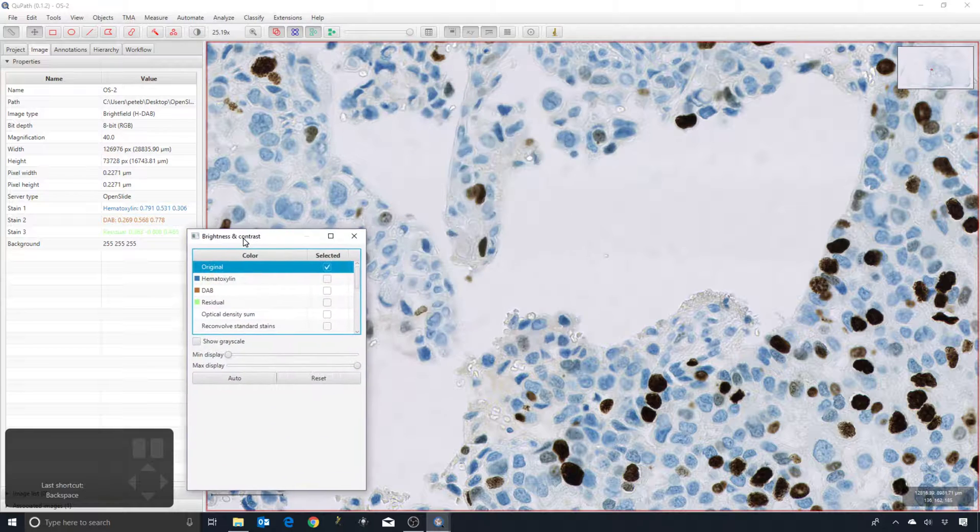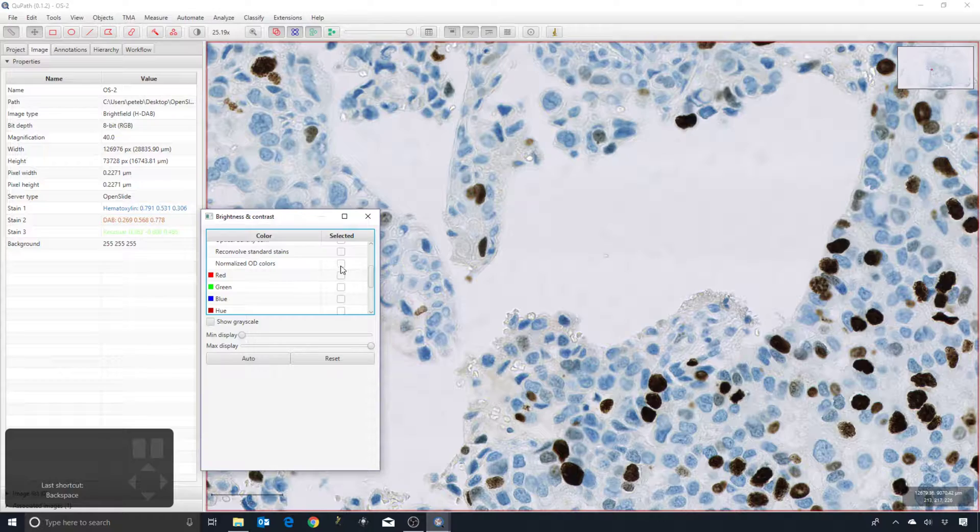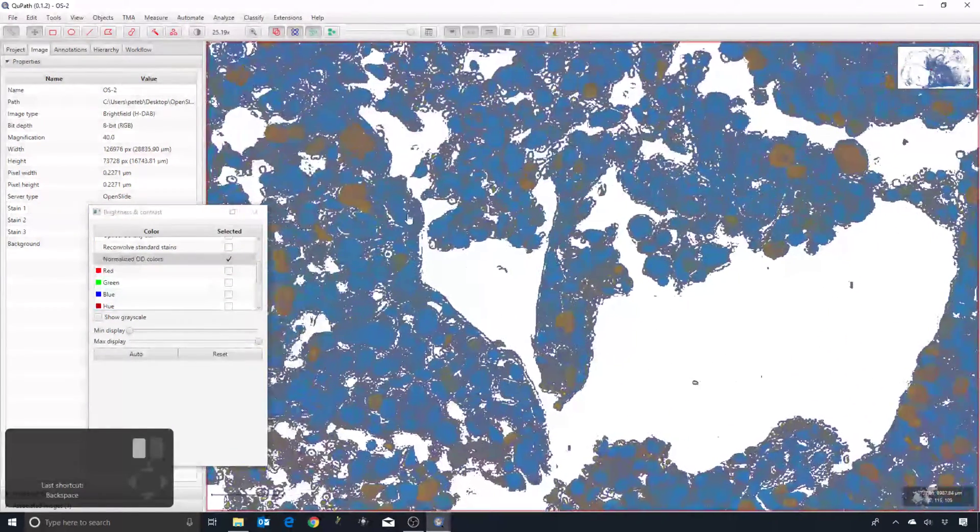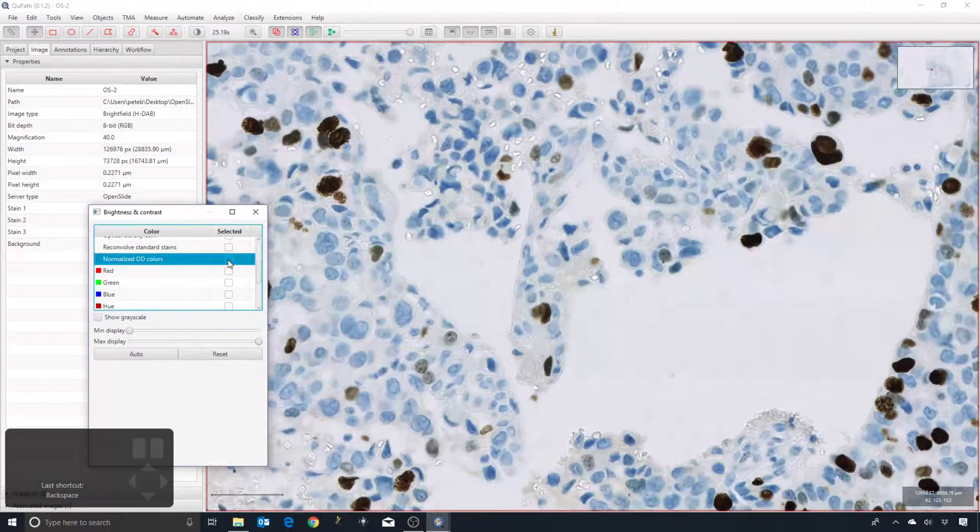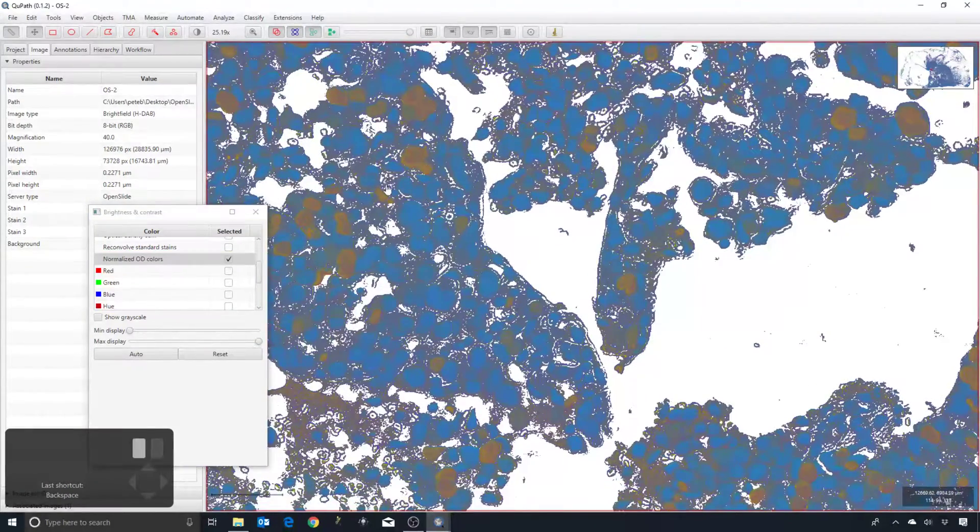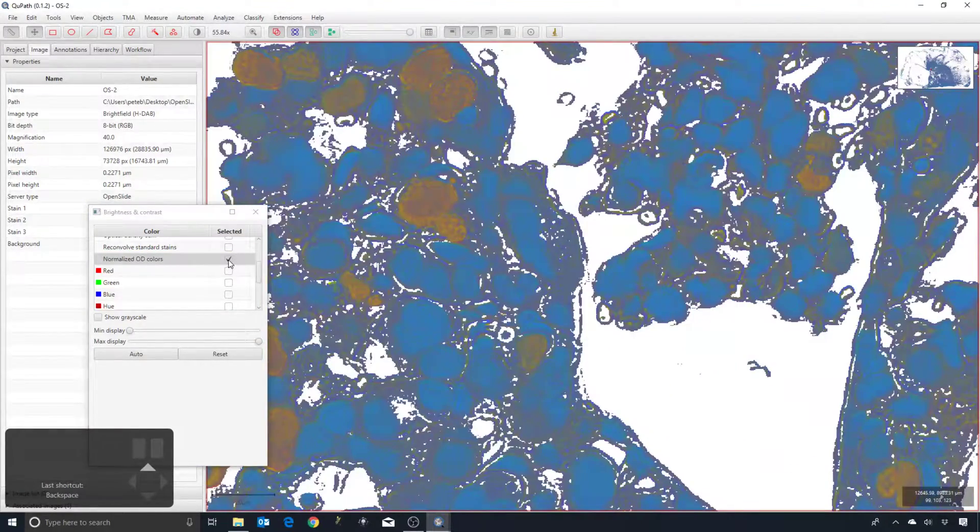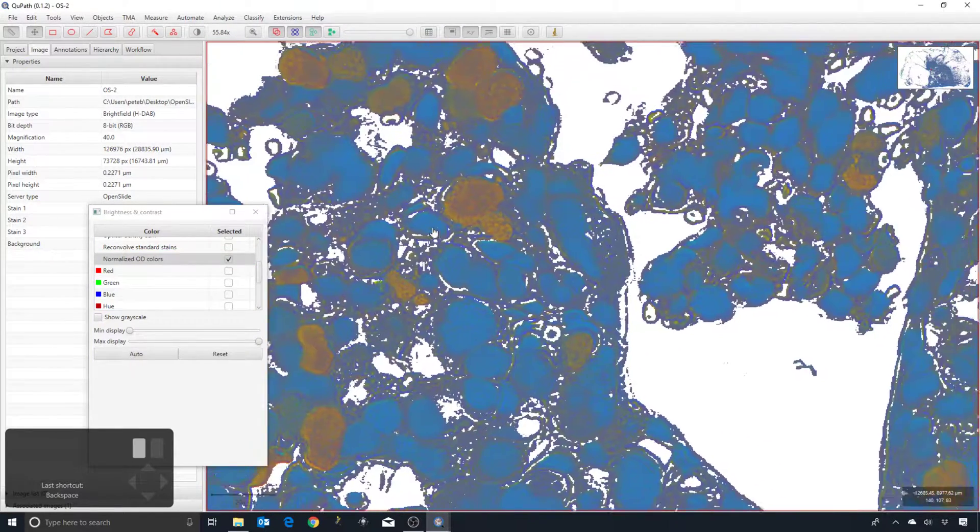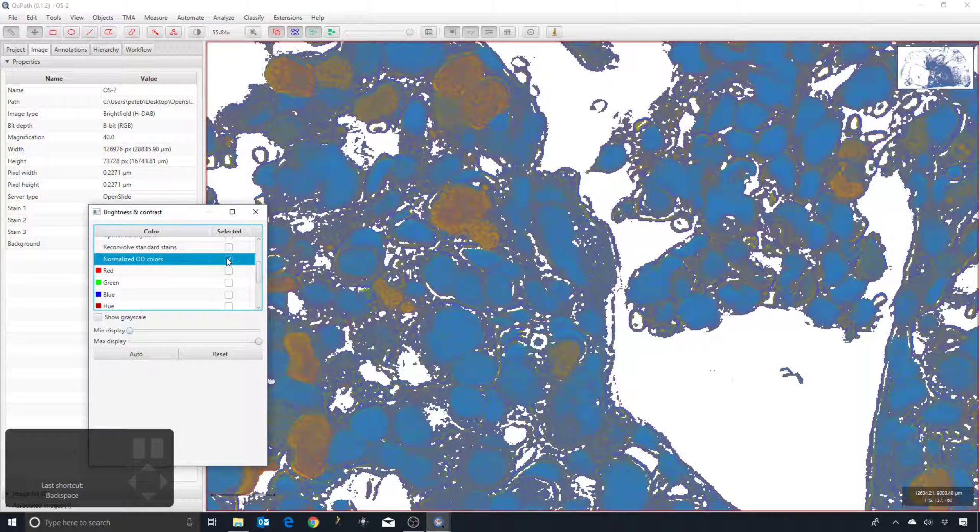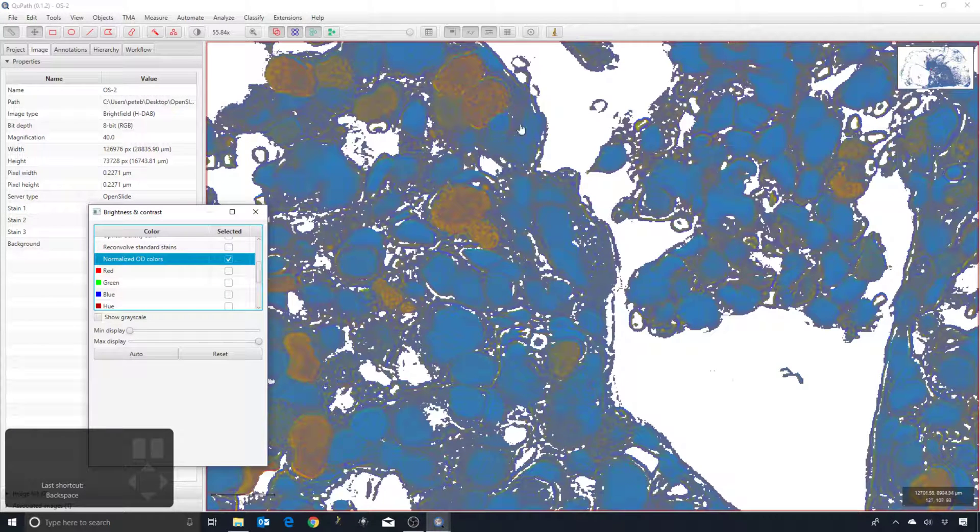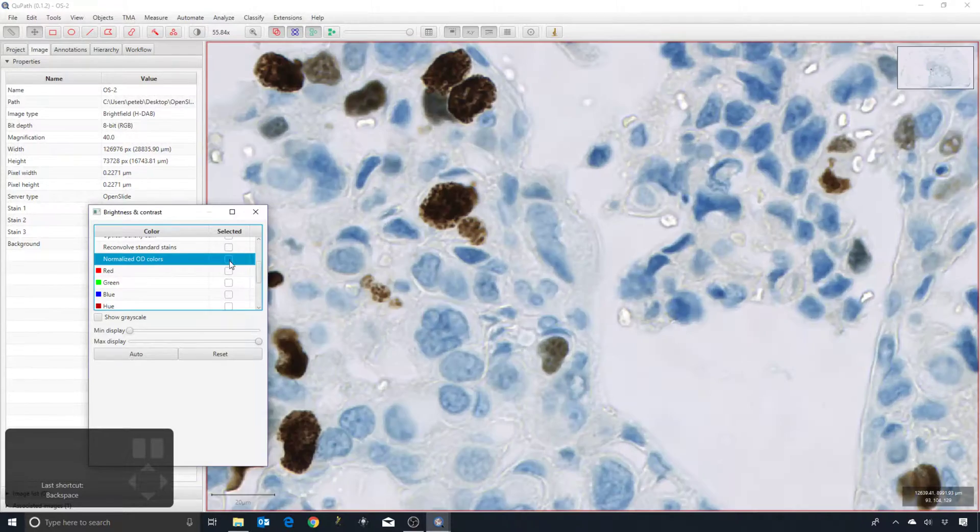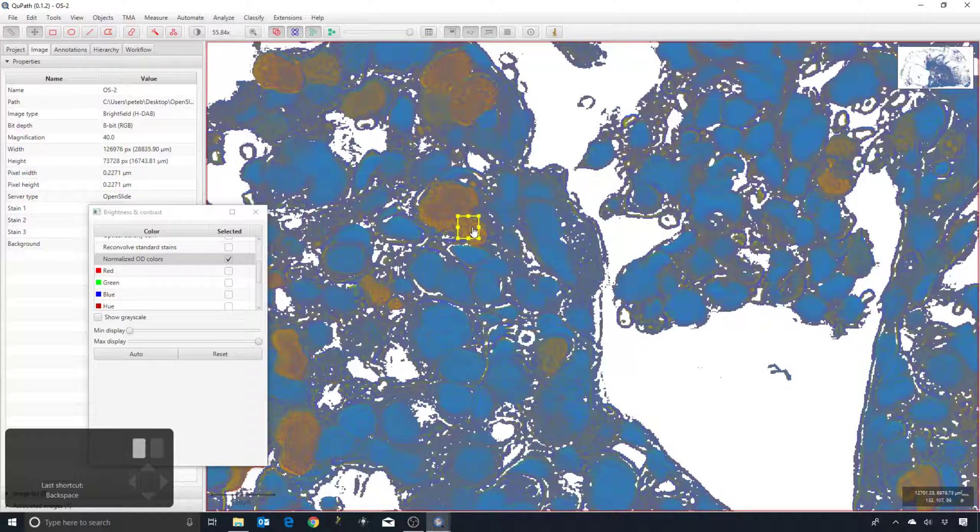But something that can help slightly is that under the brightness and contrast we have a list of color transforms. One of them is normalized OD colors, which tries to give you a visualization of the image with the intensity of the stains removed. This is maybe not more accurate, but more characteristic of the color of the stain as opposed to the intensity. You can see these sort of grayish areas—if you remove the fact that they're quite light, then you can see the actual color that is underlying them. With this kind of visualization turned on, then you can select an area that might be appropriate for the brown color.